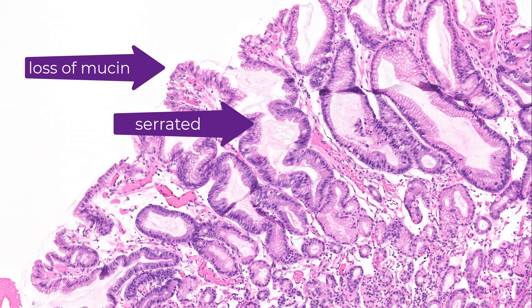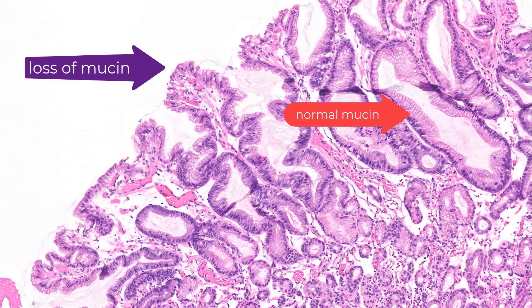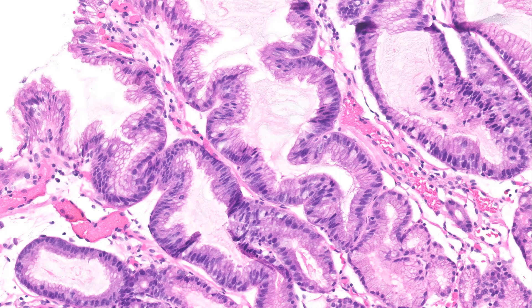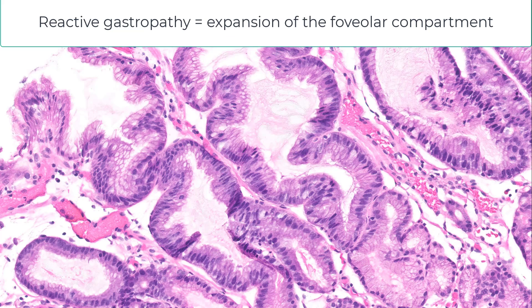Again: serrations, loss of mucin. Up here, that's normal foveolar mucin — that large apical cup. Down here, this is loss of mucin; you've lost that apical cup of mucin. And further down, there is virtually no mucin whatsoever. I don't usually talk mechanism, but this is just too interesting to let go. Basically, what is reactive gastropathy? It is nothing but an expansion of the foveolar compartment.